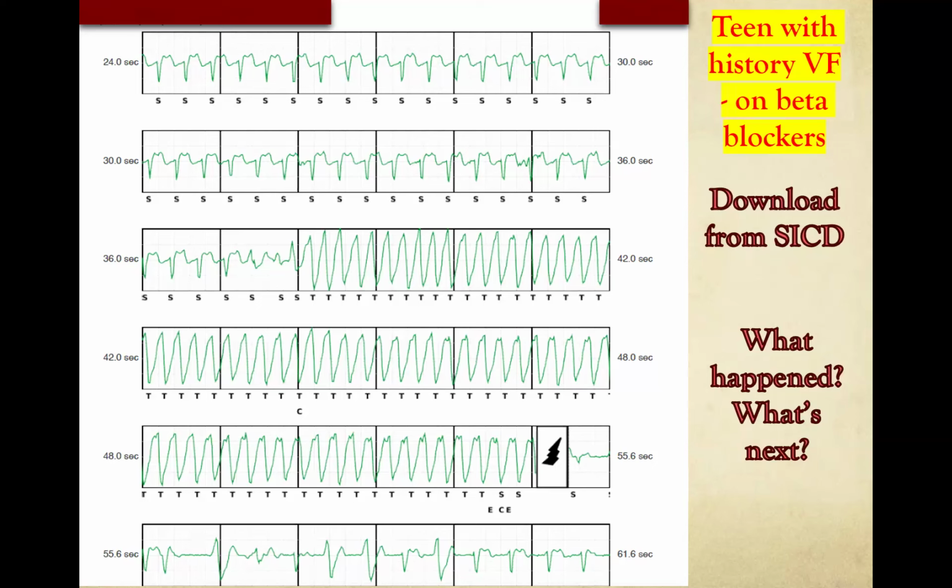It's interesting, in the old days, ICDs were very, very large, much larger than they are today. And so in the first 10 years of ICDs, it was routine to put the ICD in the patient's abdomen because there were concerns about erosion if it were in the standard subclavicular area.